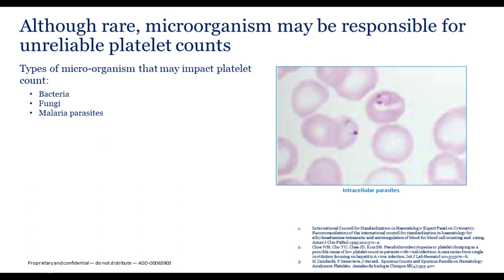Although rare, microorganisms may be responsible for unreliable platelet counts. In this smear, you can see intracellular parasites. In that case, sometimes as the red cells hemolyze, the parasites may become free and may falsely impact the platelet count by increasing it.